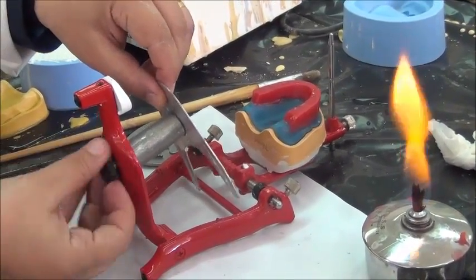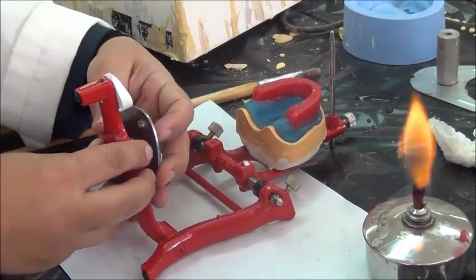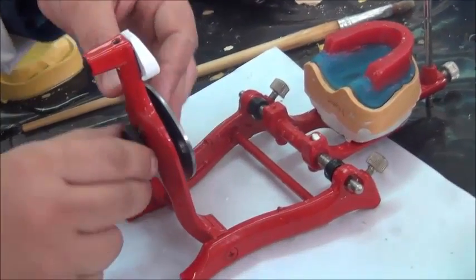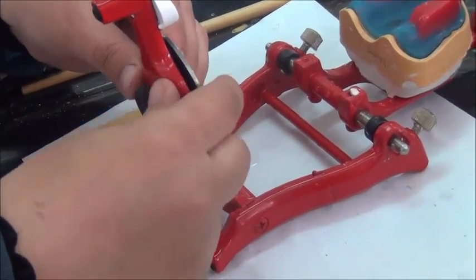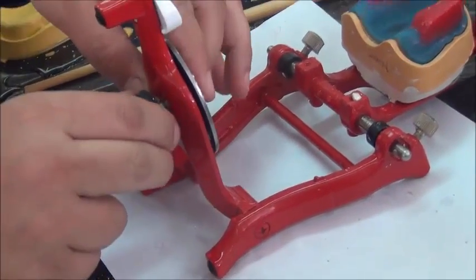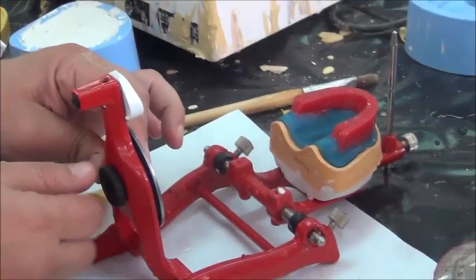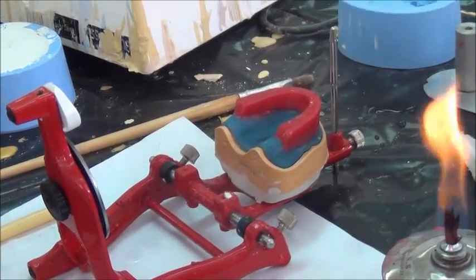And we're going to attach, instead of it, another ring that comes with the articulator. The ring will not go into position until these indentations go into the depressions that are opposite to them. So we make sure they fit into their depressions. Now we can secure the screw. And now we are ready to do the mounting of the lower.